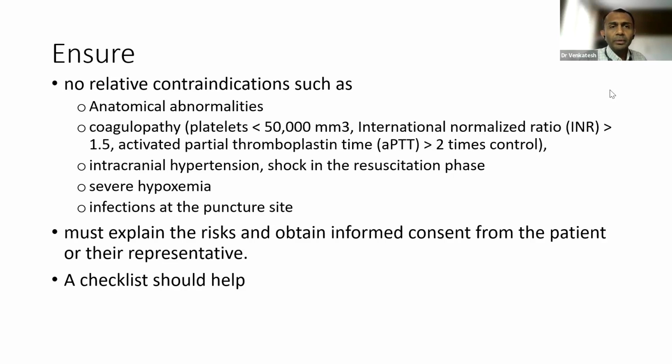We generally avoid doing procedures if the platelet count is less than 50,000, INR more than 1.5, APTT more than 2 times, intracranial hypertension, shock, severe hypoxemia, or infections at the puncture site. So these are all again relative contraindications. You should always weigh the benefits in every case at that point of time.